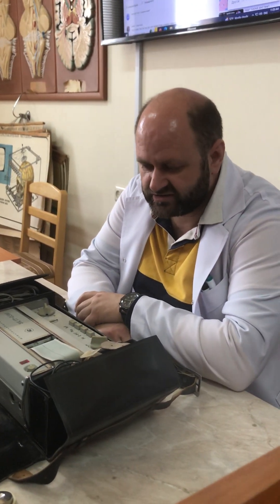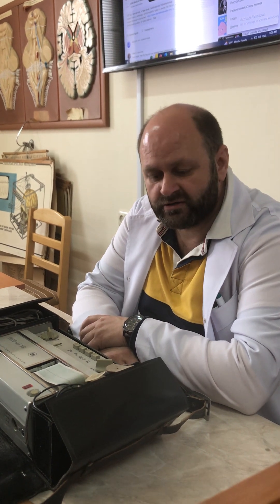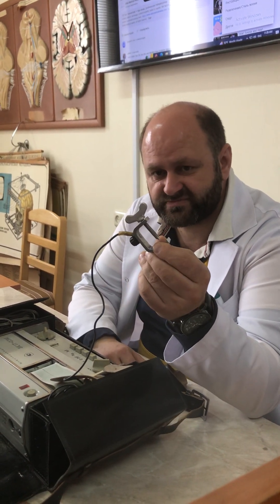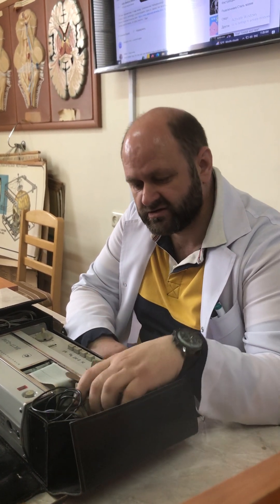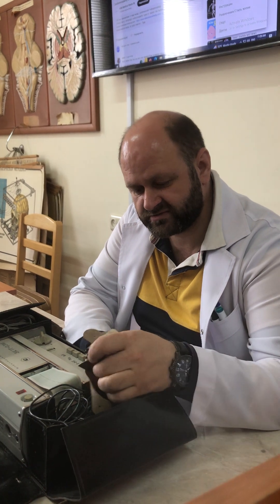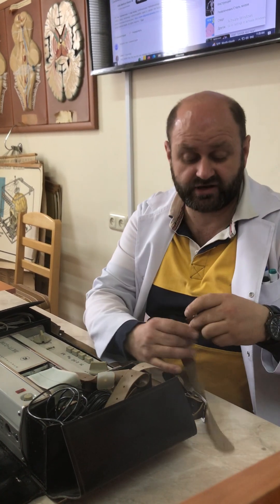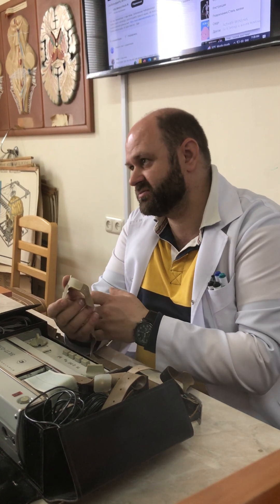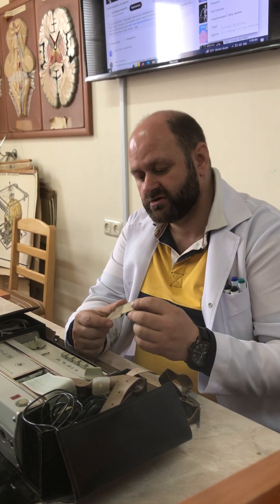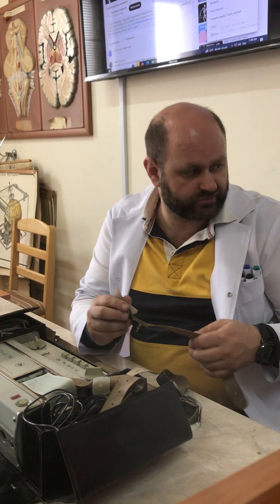Regarding the registration of electrical activity, it is possible to register under a negative charge. In that case it will go to our ground, and grounding means specific wires by which we find the location where we can ground the devices. Together with this, we position some electrodes to register that activity. We use electrolytes placed between the skin and the electrodes to realize the registration.